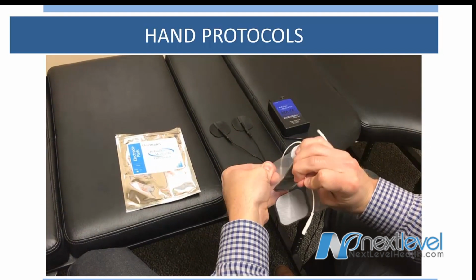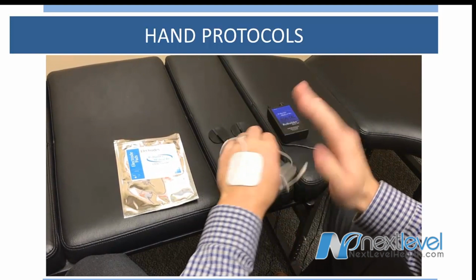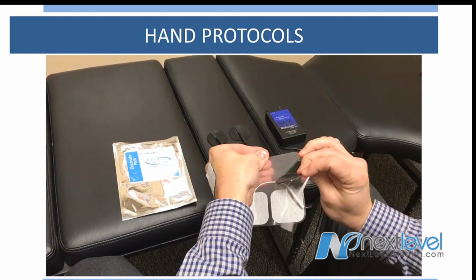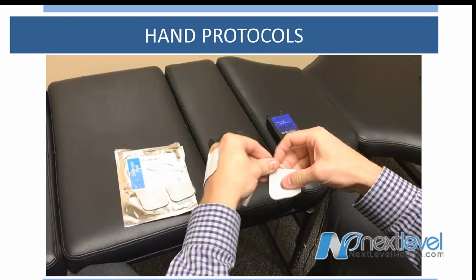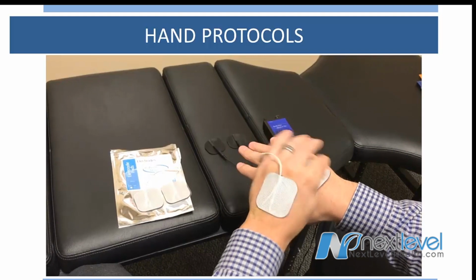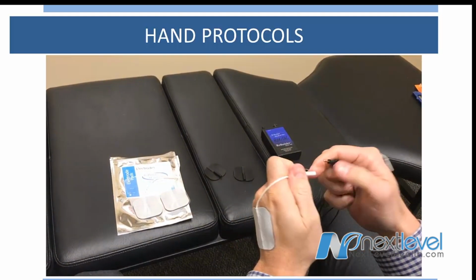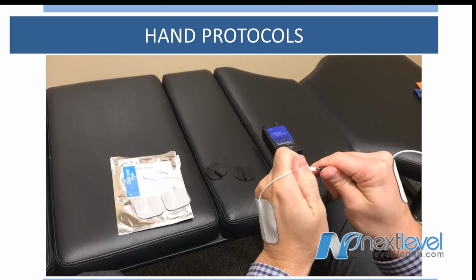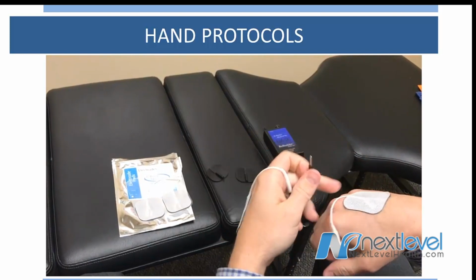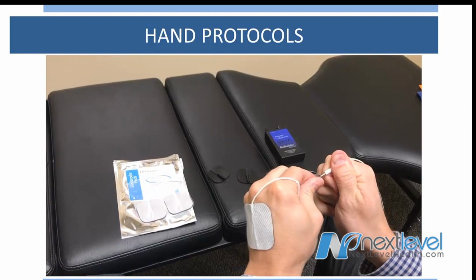You're going to want to peel off one sticky pad, put it on top of your left hand, then peel off another sticky pad and put it on your right hand. Simply plug them in. Then you're ready to turn the unit on.